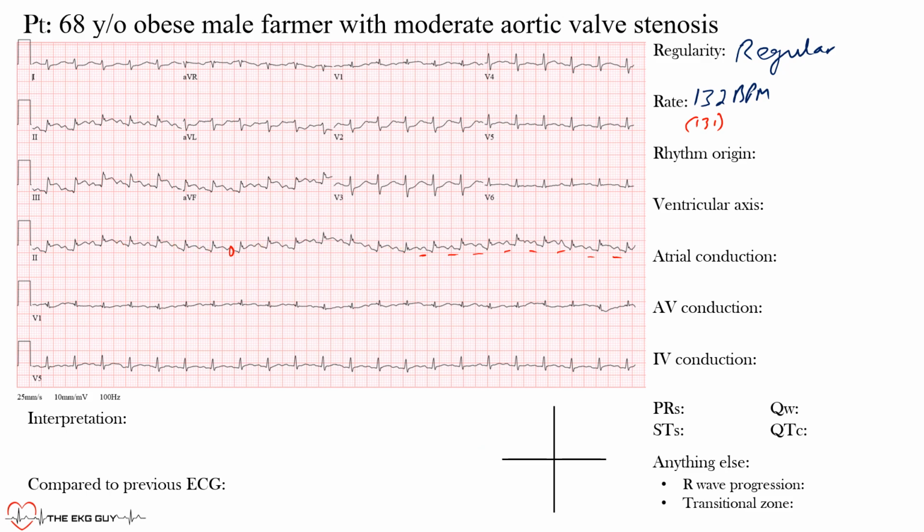Something very important, and I think often taken for granted and not really understanding why we do have that. So let's try to understand. You'll see as our teaching progresses. The goal is for you to understand why you see what you see on the EKG all the time, okay? So here's the right atrium, left atrium, right ventricle, and left ventricle, okay?